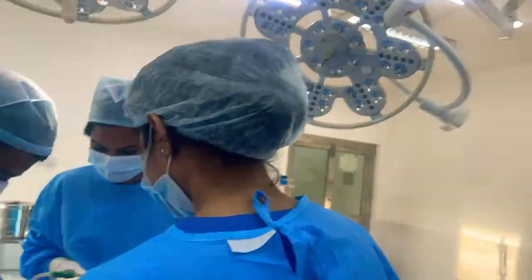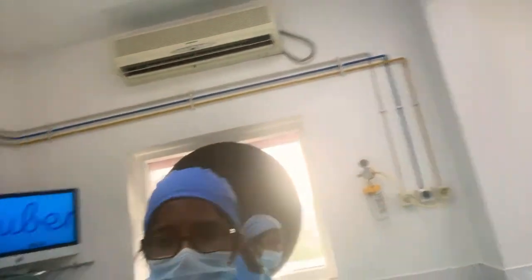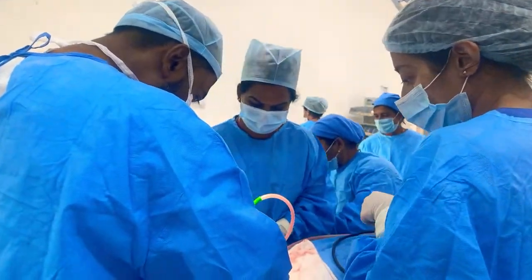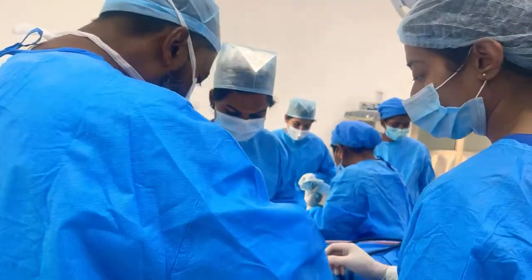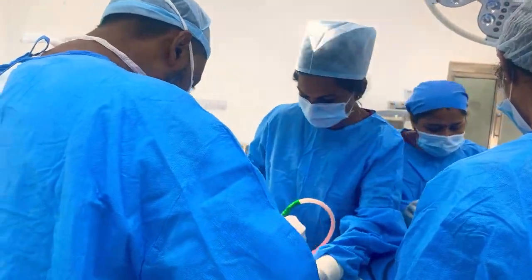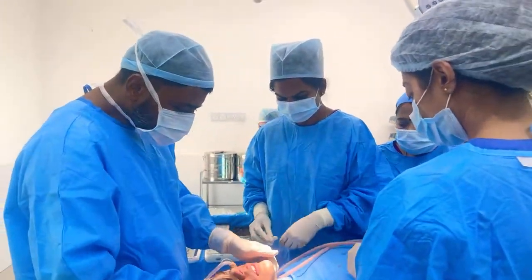Alright, wash. So we're just going to check now, since we fixed the segment and since we moved the chin on the angle. I'll show you how it's going to look for this. See that?